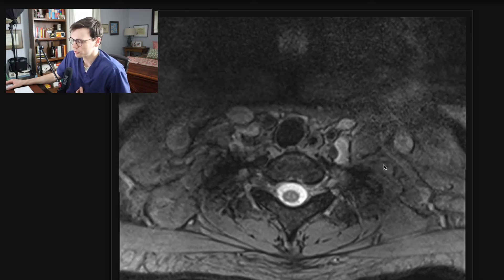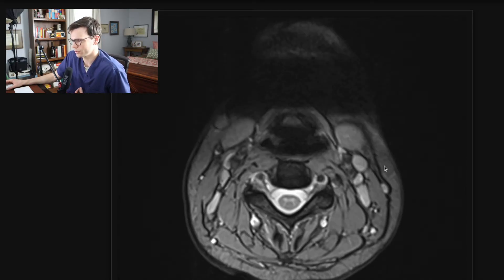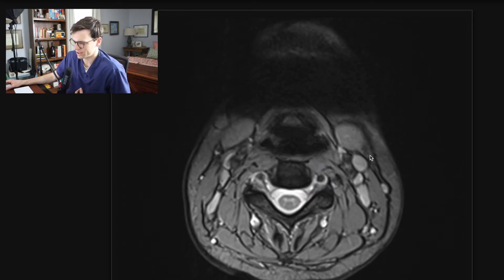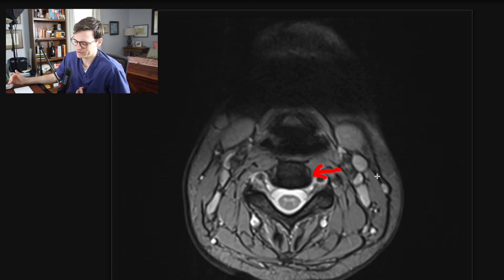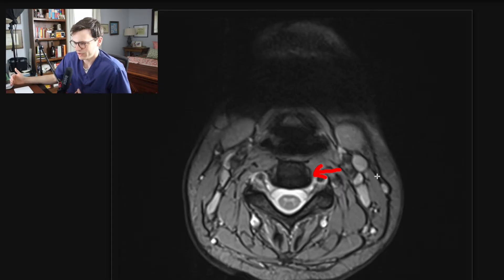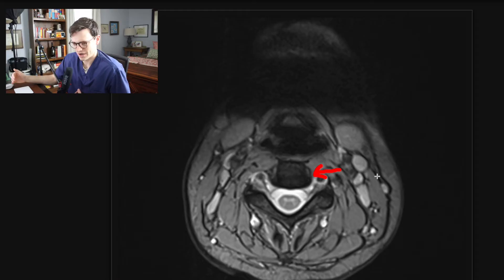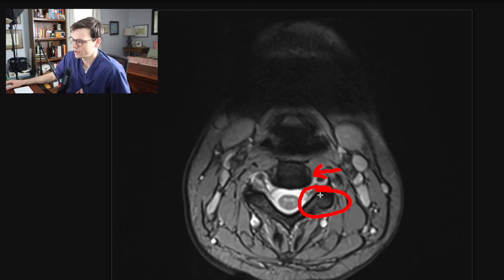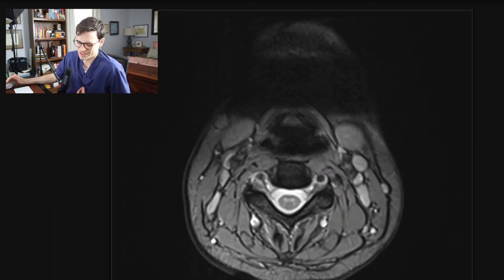After looking at the canal, you then have to think about the neural foramen — the structures I'm circling now, where the cervical nerve roots exit. There are a couple things that can cause stenosis of the foramen. The first is uncovertebral hypertrophy: the uncovertebral joint is where two cervical vertebrae articulate, and with wear and tear you can have osteophyte formation — bony overgrowth that can narrow the foramen. That same process can happen at the facet joints, which are posterior, while the uncovertebral joint is anterior. The other thing to always think about are discs or disc osteophyte complexes — those are the three main causes of stenosis in the cervical spine.